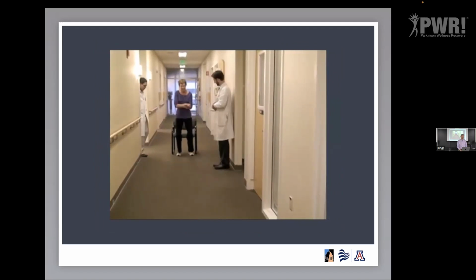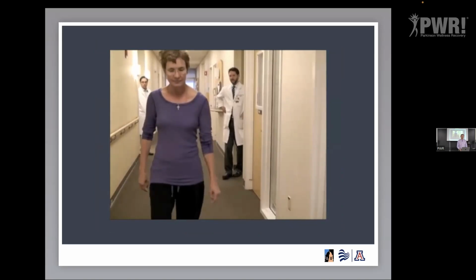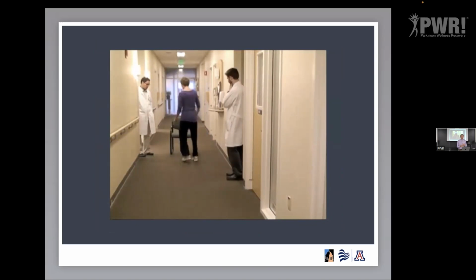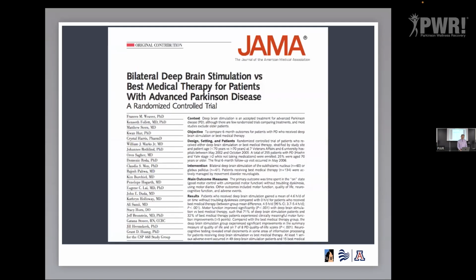So here she is with DBS. This is no meds, just stimulation. And we don't make people perfect, but we make them a lot better. We can make movements more natural. We can speed up movements. I like the little wave she gets at the end here. Now, if you feel her, she's still a little rigid. And if you ask her to hold a glass, she intermittently has a little bit of tremor, but she's significantly better than she was just with medications alone.